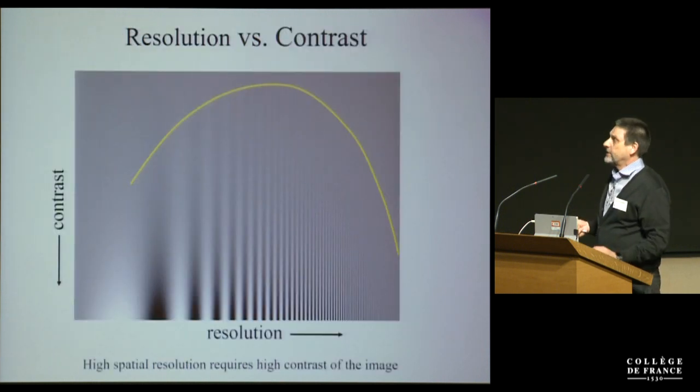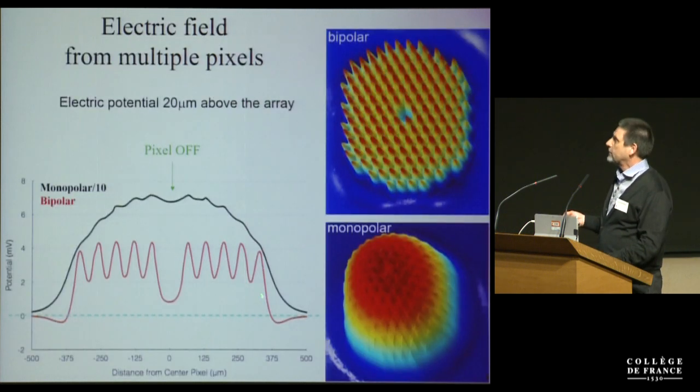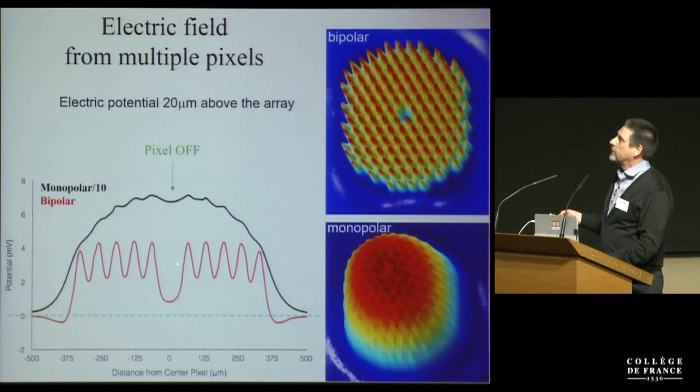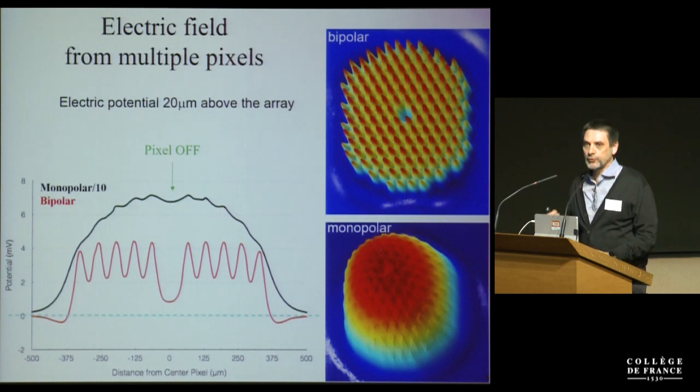It is a much larger number of pixels, and we hope it will be sufficient for recognition of objects. Another very important fact in vision is that contrast and acuity are related. You can only see high resolution if you retain high contrast. To retain high contrast, we have local return electrodes. So when you activate many pixels together and you turn one off, for example, you will see it because local return electrodes localize the field. But if you don't have a local return electrode and your return electrode is remote, for example, in a power supply somewhere, the electric field adds up, and when you turn one off, there is very little reduction in the potential, so you can't resolve it.